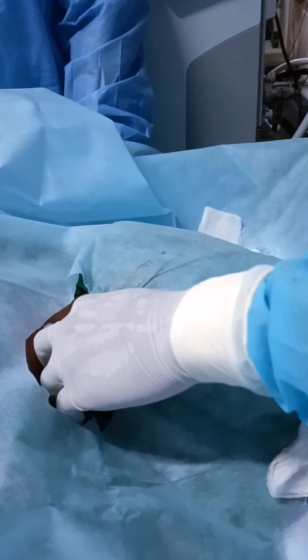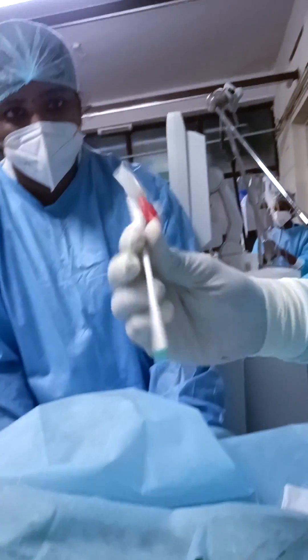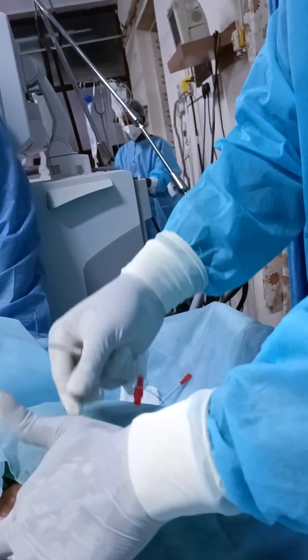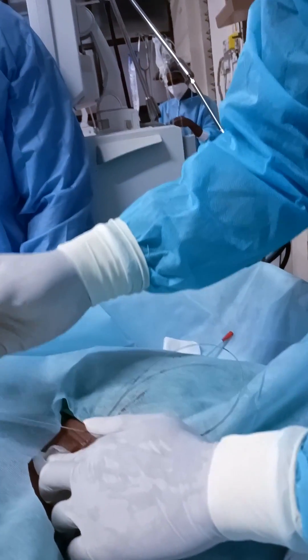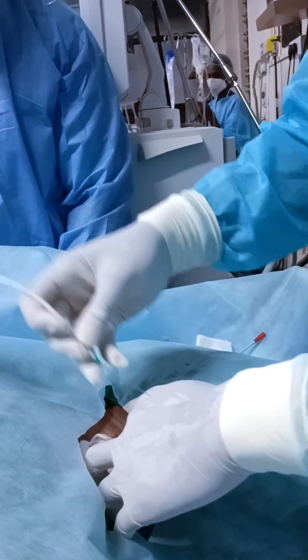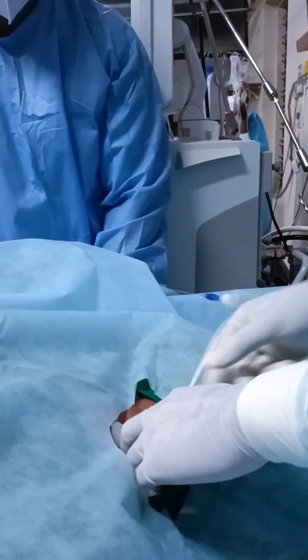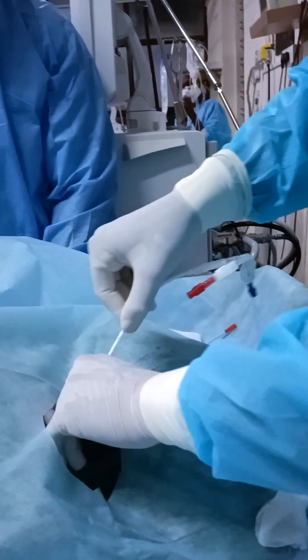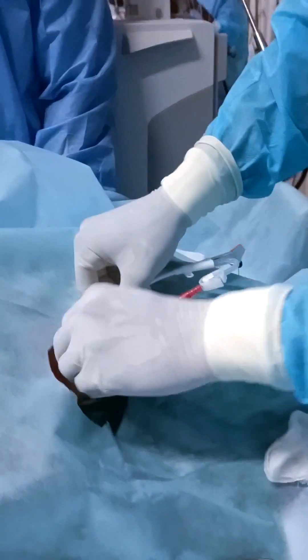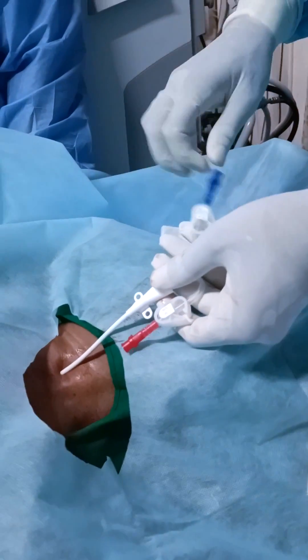After removing the second dilator, now comes the main part. This is the HD catheter — double lumen. You again thread it over the guide wire and make sure the guide wire comes through one of the ports. You hold the tip of the guide wire and gently insert the catheter into the IJV.